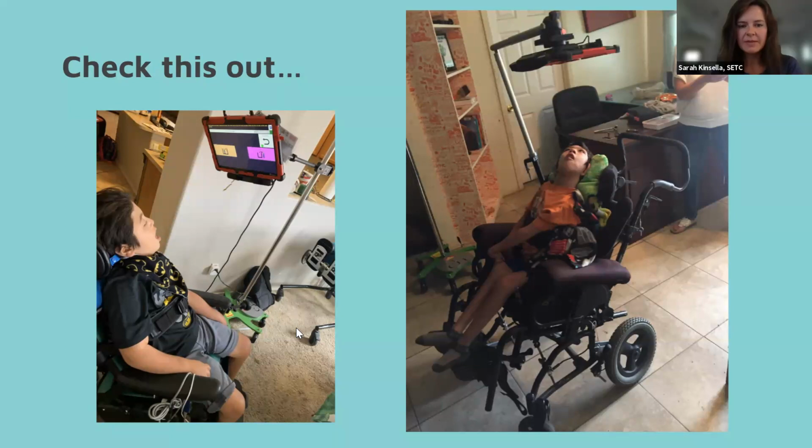Thanks, Brenda. And is it called the ET roller? Is that the name of that one on the roller, the little frog roller at the bottom, guys? It takes the place of the rollers that go under the beds at hospitals, or that are all over your classroom and everybody stuffs their feet on. It's a super small base. I think it's 18 inches end to end. And so it counterbalances. It's heavy, but it counterbalances. And so it's easier to take around in a home and probably in a classroom. And I think we might have those to rent. We do. We have an ET roller to trial.